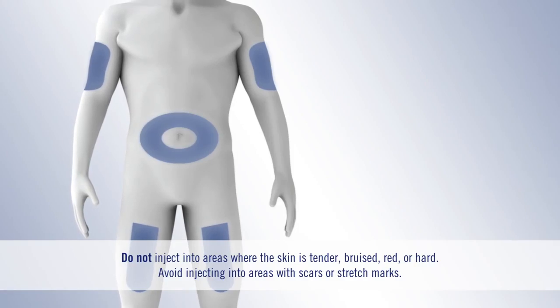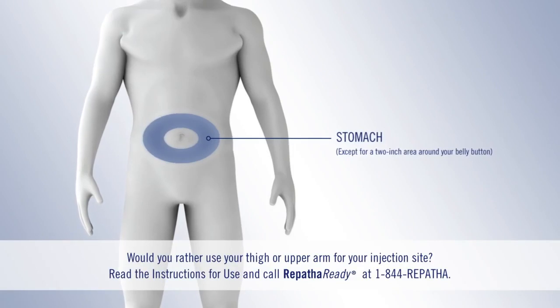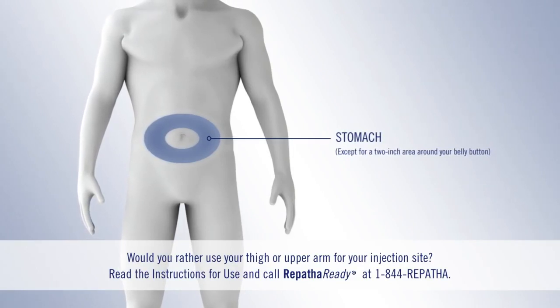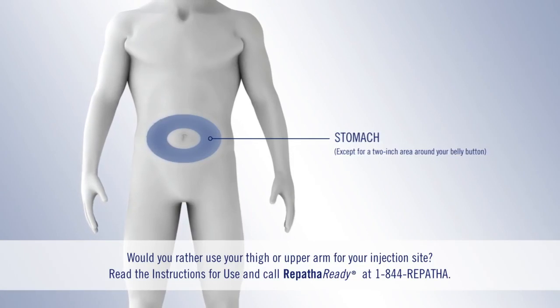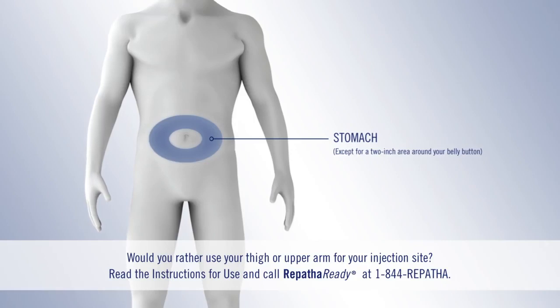Always avoid areas where the skin is bruised or hard. Now let's get ready to inject. We're going to show you how to inject in your stomach, but if you want to see how to inject in other areas, check out the instructions for use on this website.